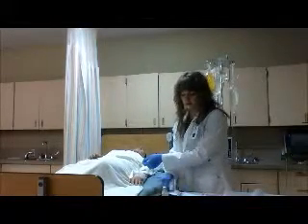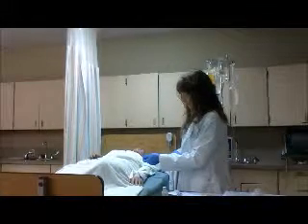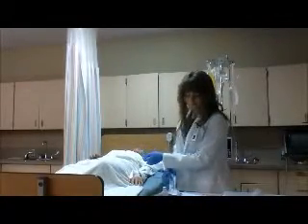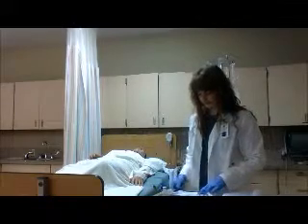Alright, and then I'm going to take my flush, and I'm going to give my flush over another minute, make sure it all goes in over a minute. I'm going to be watching the clock as that goes in.